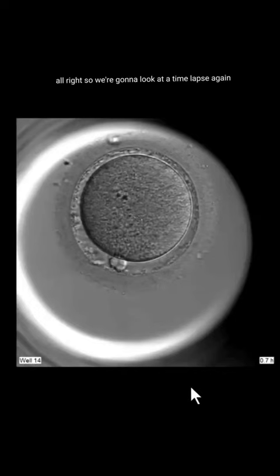All right, so we're going to look at a time lapse again. Just so you know, on the bottom right, this is the time elapsed since insemination. So it's kind of cool to pay attention to that. And this is the position that the embryo is in.